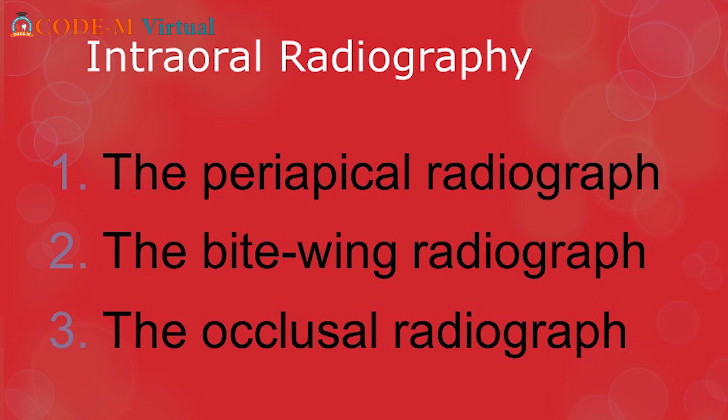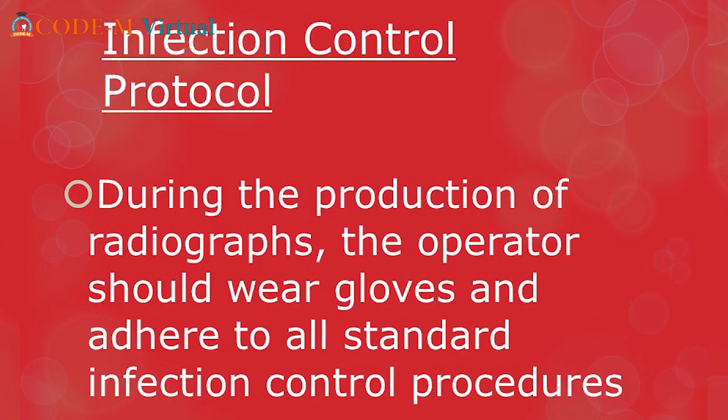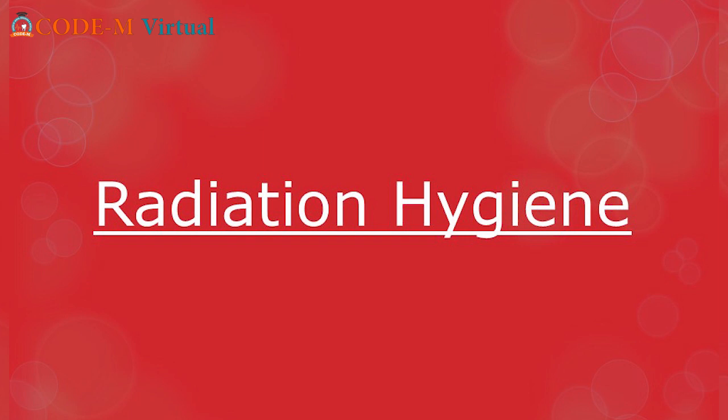The patient is covered with a lead apron and thyroid collar. We also take care of the infection control protocol. During the production of radiographs, the operator should wear gloves and adhere to all standard infection control procedures. We also take care of the radiation hygiene. Radiographic prescription should be based on the standardized guidelines of the American Dental Association and in accordance with the ALARA, as low as reasonably achievable, principle of radiation hygiene.